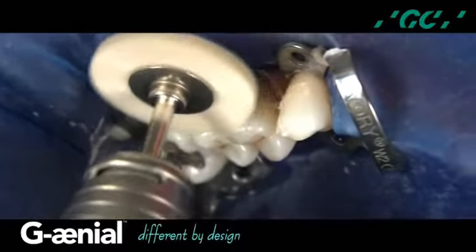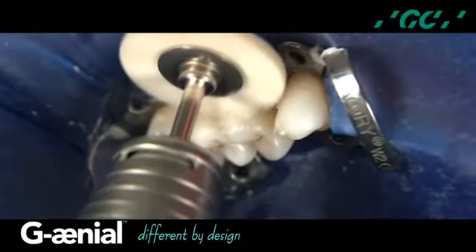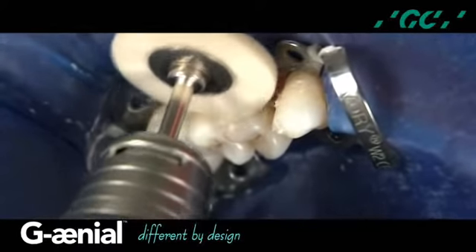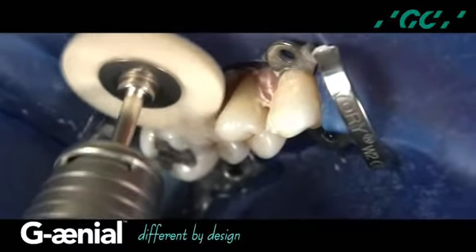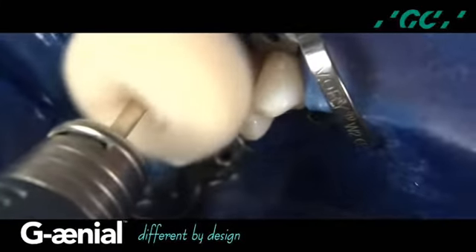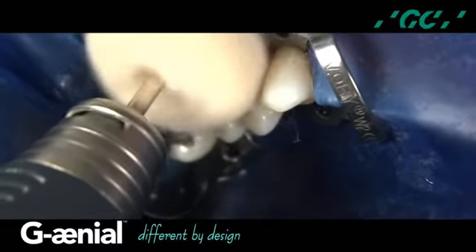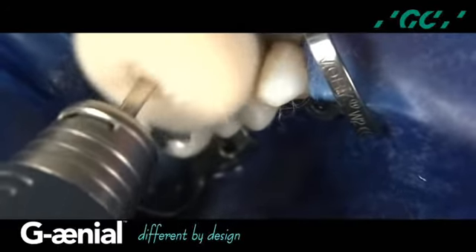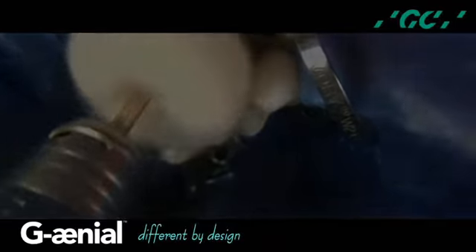The definitive polish and surface reflectivity is accomplished with diamond polishing paste and a soft white goat hair brush from the Sarah Shine kit by Brassler. After rinsing and drying the enamel surface, a final polishing surface gloss is achieved by using a dry cotton buff with an intermittent staccato motion.